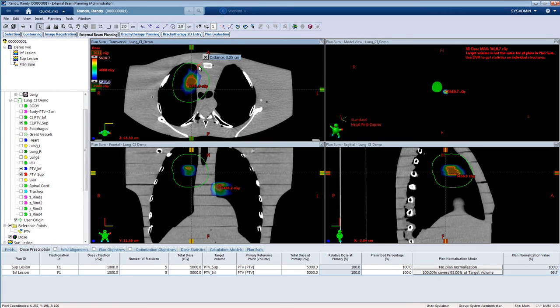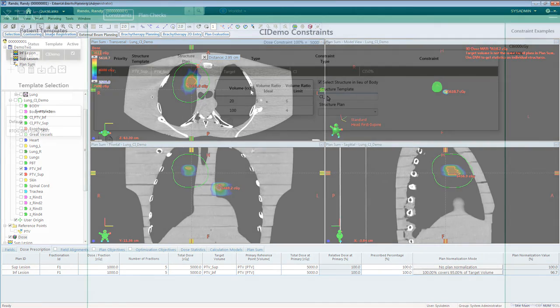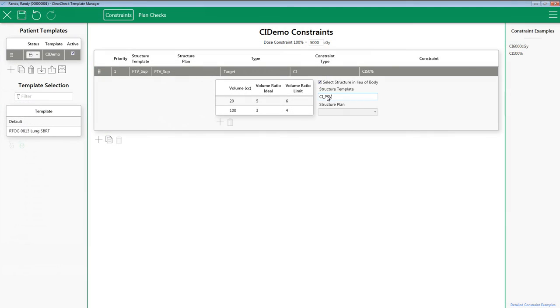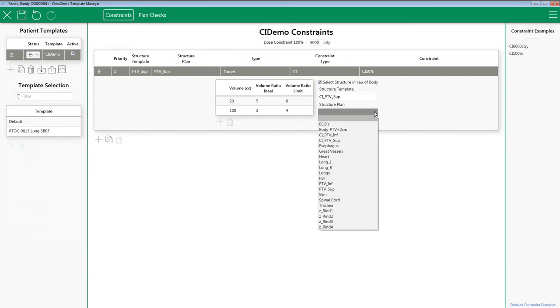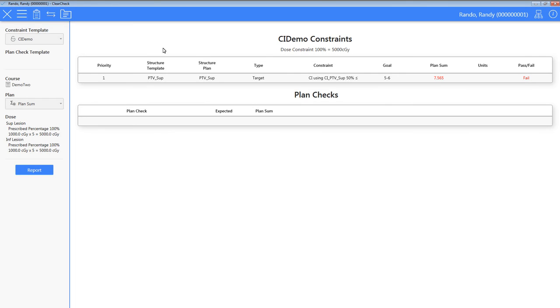Instead, what I can do is create a 3cm expansion on the PTV sup target. This structure I'm going to call CI PTV sup. Now when I'm in ClearCheck, I can set this to CI PTV sup and pick the same structure from the Eclipse dataset. Now when I run my conformity index, it will only look at the dose and the volume of that dose that is found within the structure.